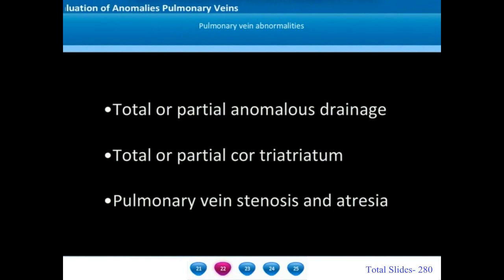With this introduction about how to visualize a normal pulmonary vein, let us move on to the various pulmonary venous abnormalities that we see in clinical practice.